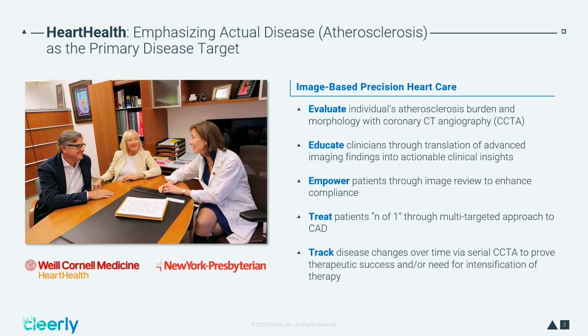Around 20 years ago now, we started using CT angiography. We used CT initially mostly as a non-invasive tool to better understand coronary artery disease. When I saw my first scan, it was a 4-slice CT scan, and I thought, this will fundamentally change our understanding of coronary vascular biology. So for many years, we used this as a tool to enroll patients into clinical trials, understand what we were looking at on the image, how that affected somebody's outcome, and how we could influence the natural history of that outcome in a favorable fashion.